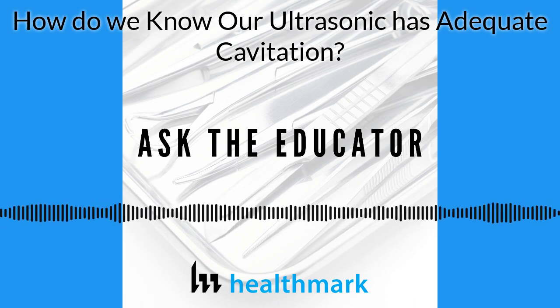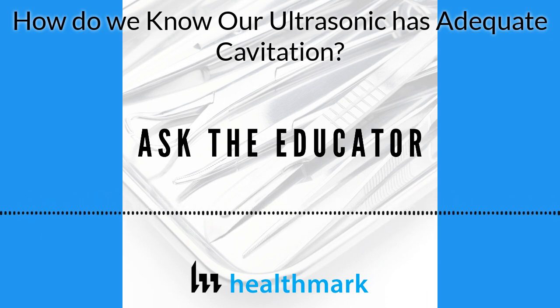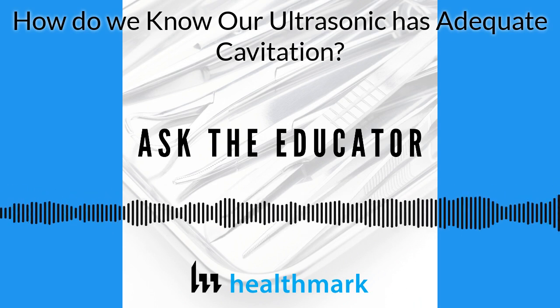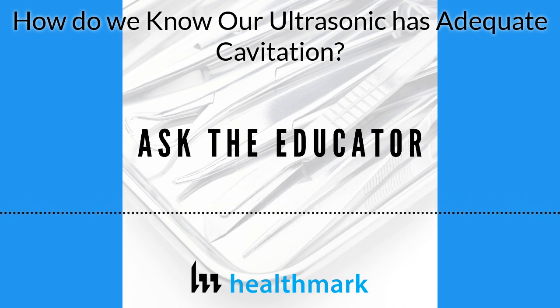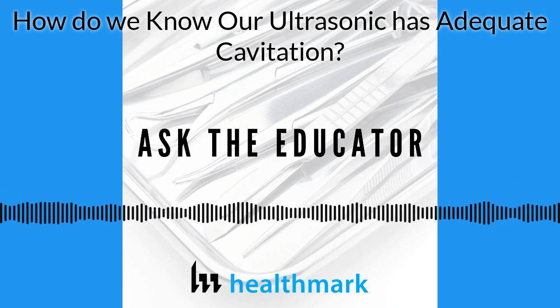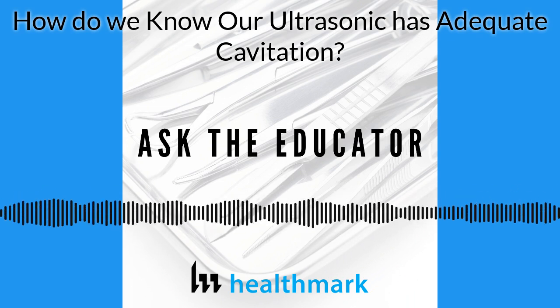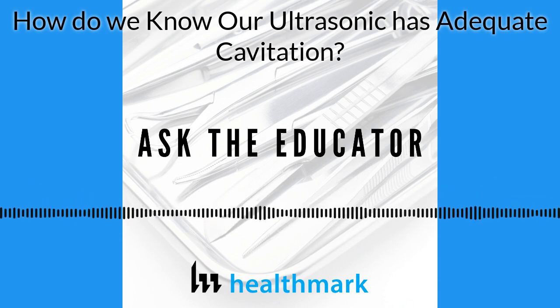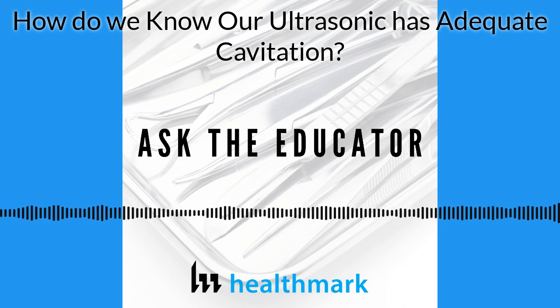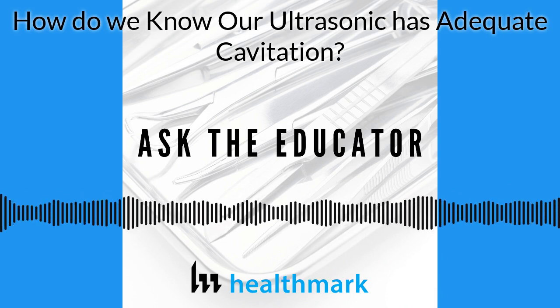We know there are many things that affect cavitation, but there's three I want to focus on, because we're going to hit this multi-level, and this is very important. We get questions, and that's why we're doing this podcast, is they say, hey, I use your SonaCheck, and the top level of my 3-level isn't passing. How come this isn't working? And it goes back and forth. Well, besides the other factors of temperature and cleaning solution and duration or dwell time, you have to take into account 3 other things in these multi-levels.